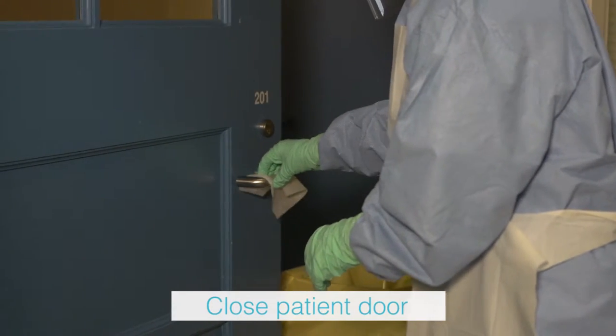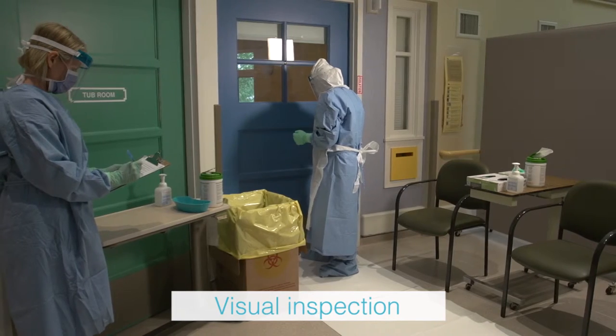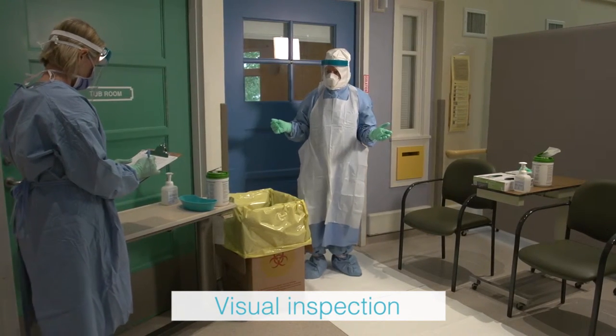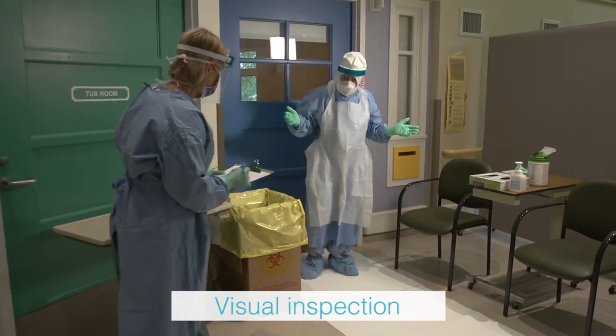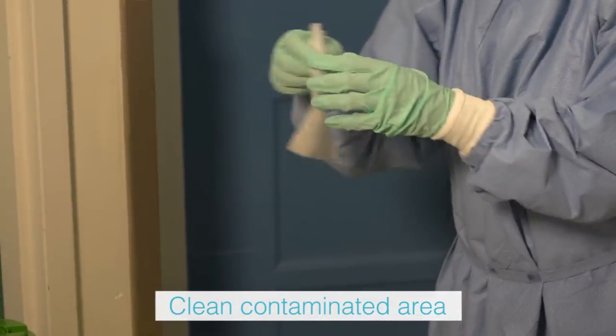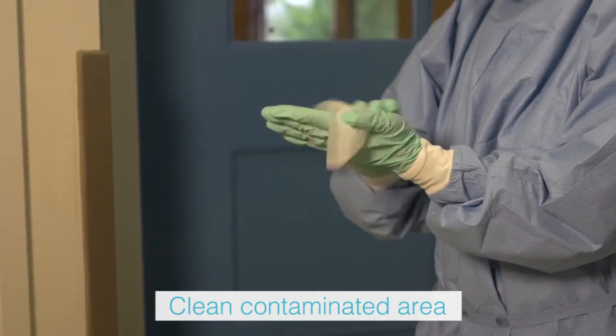The trained observer visually inspects the health care provider's PPE for contamination or tears before the doffing process is started. If any PPE appears contaminated, the health care provider will use a disinfectant wipe to clean the area.